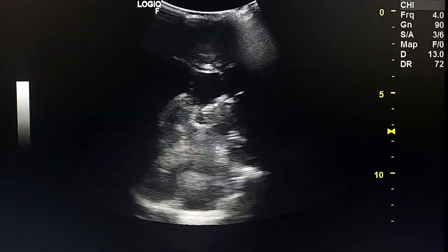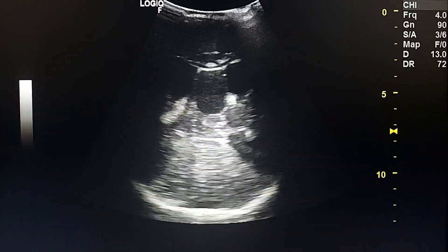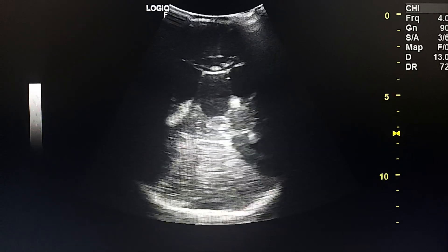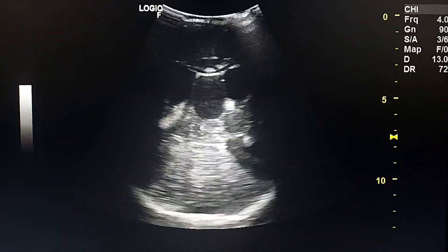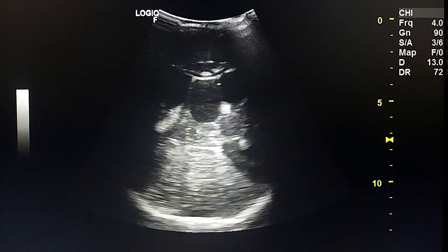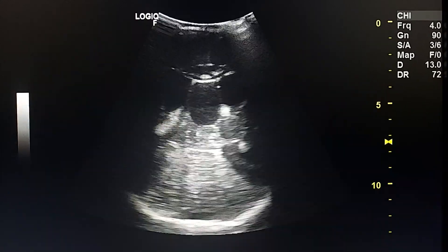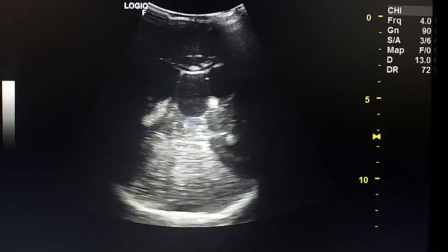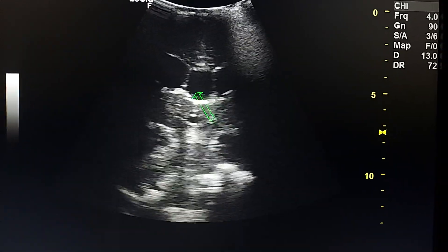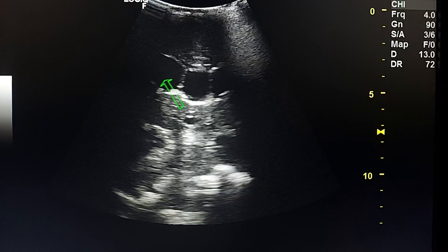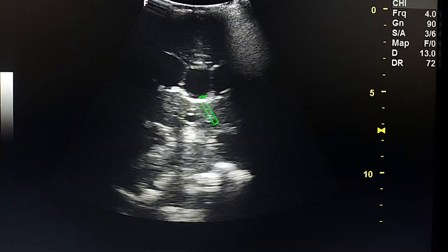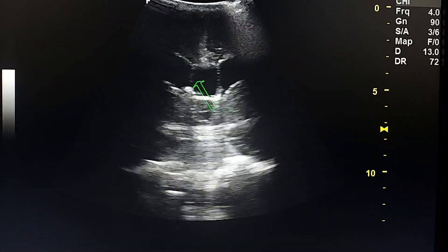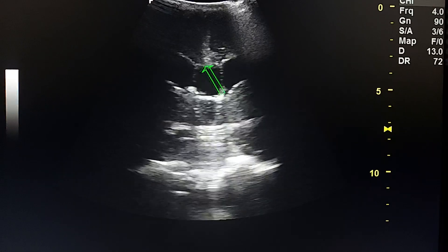This is a cranial ultrasound of a male child with hypotonia, confirmed by CT to be lissencephaly. Here we see big ventricles — this is the right ventricle and this is the left ventricle, and this is the septum and cavum septum pellucidum. This is the corpus callosum.